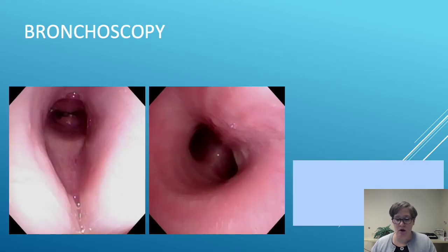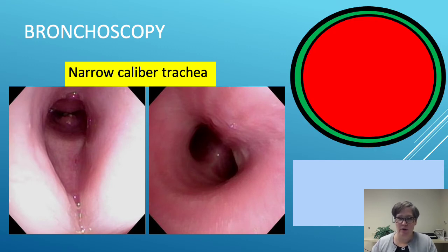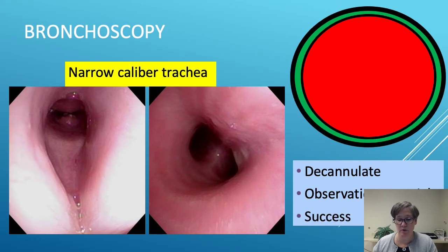So in the office, I did a flexible bronchoscopy performed through the nose. The trach tube was removed, and it was determined that she had a very narrow caliber trachea. So she was only 5'2", brittle diabetic, and I wonder how much her diabetic status had an impact on that, and probably a lot. So she was just the victim of having too large a tube for her very small trachea, even though the tube itself was quite small. So this was her situation. Her air around the tube, even though the tube was the smallest one we have, was still too large to accommodate air that she could breathe. So collectively, she and I decided to decannulate her in the office, and then followed her up with airway observation for a couple days in the hospital, and she has been successfully decannulated and remains so.